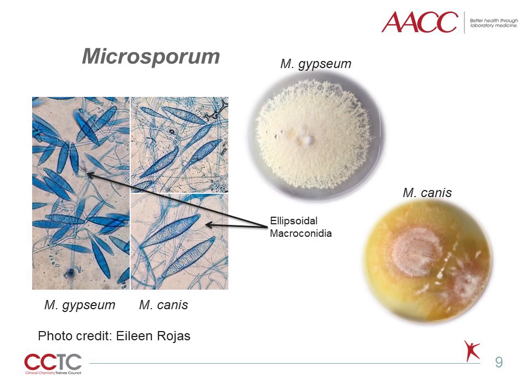Compare the walls of M. canis, which is very similar in appearance to M. gypseum, but note the roughened walls of M. canis. The walls of M. canis are also thick, which again is different than M. gypseum, and can have 5 to 15 cells. For these small details, it often helps the mycologist to adjust the fine focus to get a better 3D appreciation for these structures. Macroscopically, M. canis has a more velvety appearance ranging from pale to yellow, as shown on the far right.